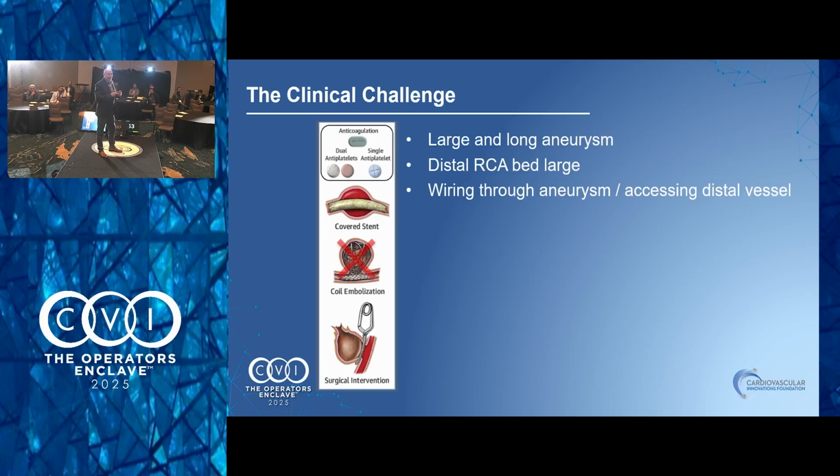Yeah. And then I think I would do this differently if I had to do it again. We thought about the lengths, because Jason was talking about how you need a really, very long device, which in retrospect I maybe would have tried to find. We all know what device I'm thinking about, Viabahn. But I thought I'd use coronary covered stents instead. And the next question is, well, how do you do this? First you've got to wire it, and then, well, let me ask, how would you do this? I'm sending this case to you. How would you do it?